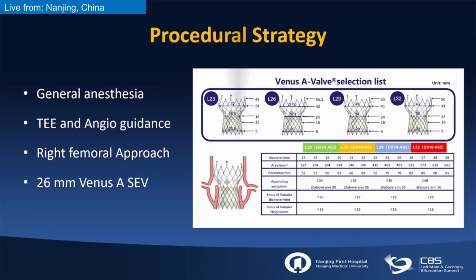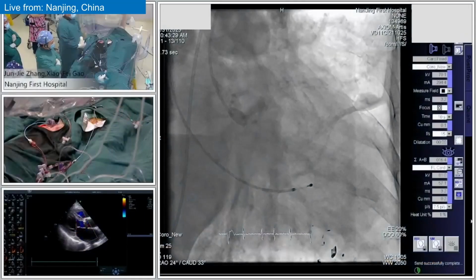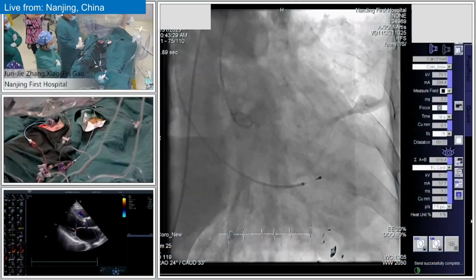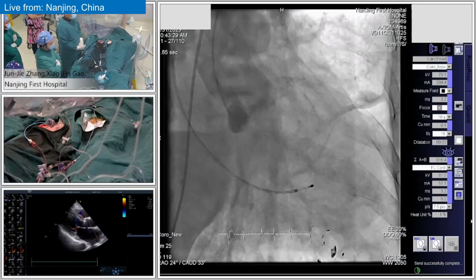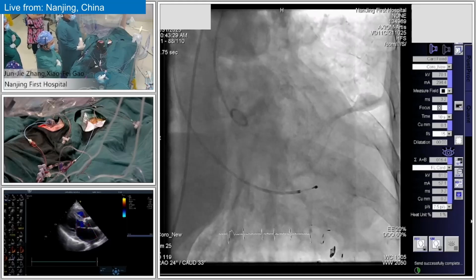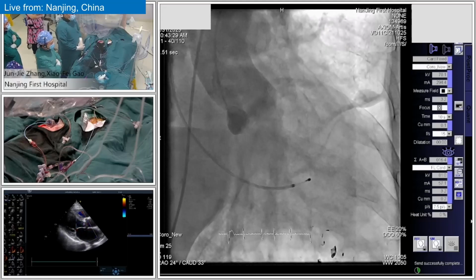Thank you for your introduction. This is a very tough case. An 87-year-old gentleman suffers from symptomatic aortic stenosis, and the STS score is more than 12%, a very high risk patient. CT analysis found a type 1 bicuspid aortic valve. Professor Zhang, how do you explain so many BAV patients being found in China?